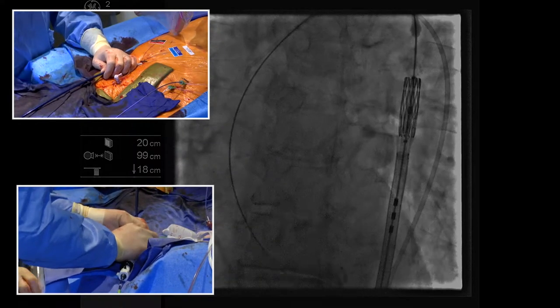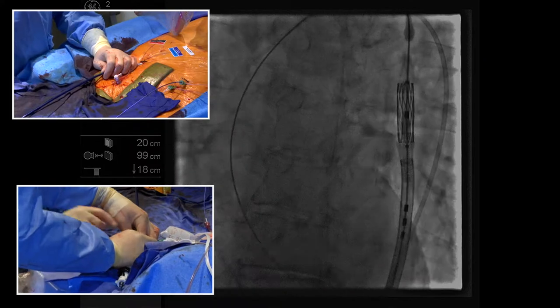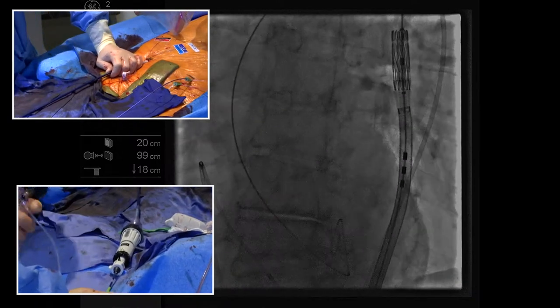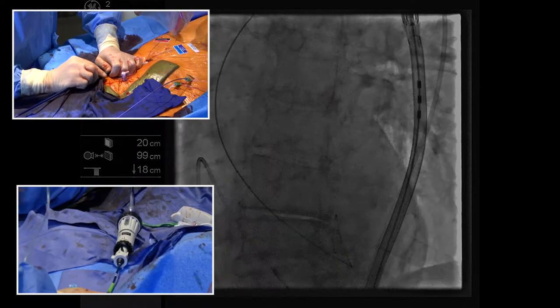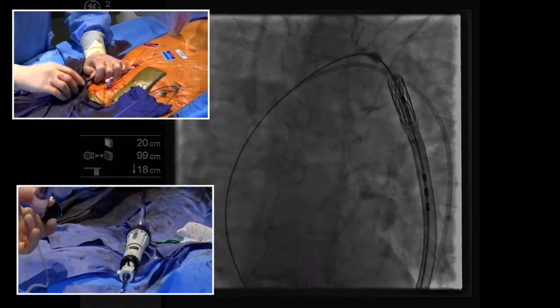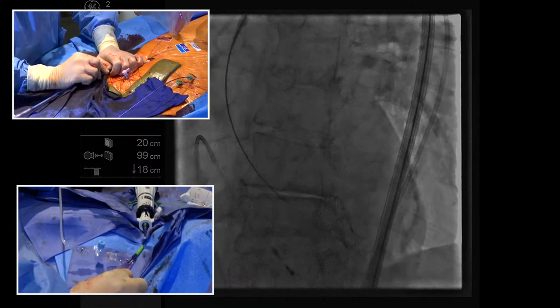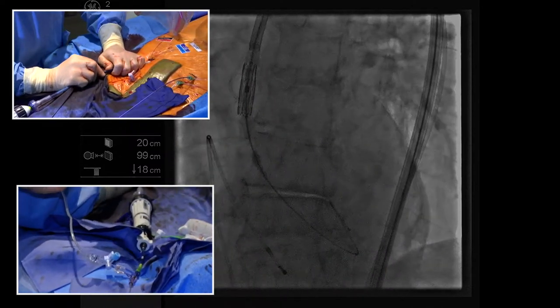There's a pull wire inside this delivery system, and Ray is turning this dial to get a little curve, so it curves over. Why don't we mag up pretty quickly? We on zero? Yeah. Okay, so just zero is fine for now. I like to watch the wire as it goes around, and we put a little back tension on the wire so you don't scrape too much stuff into the cerebral vessels. Okay, we're gonna cross.